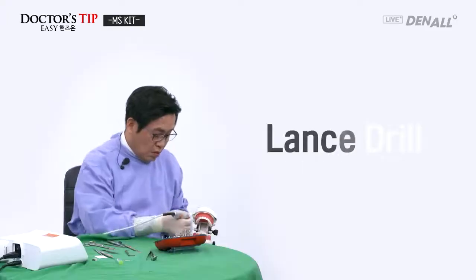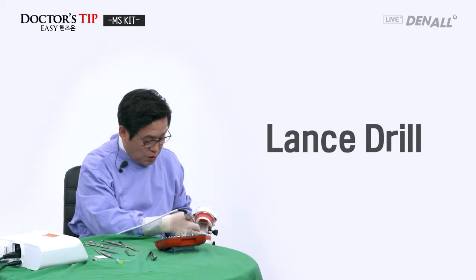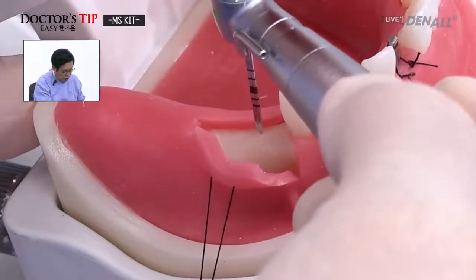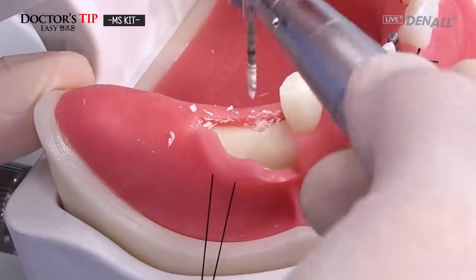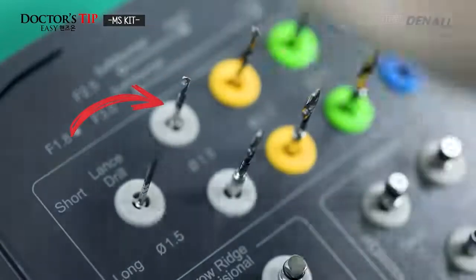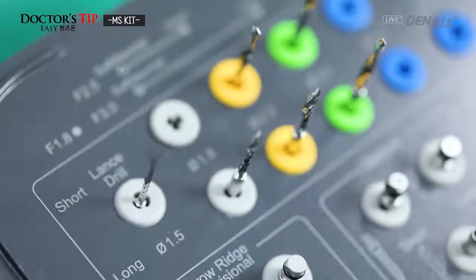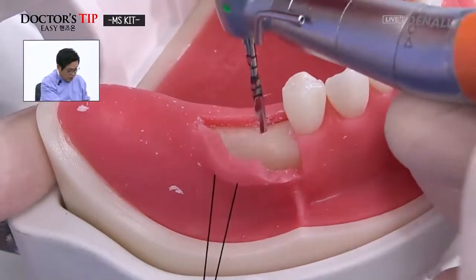Lance drill is used. After placing implants, I have to put in a provisional, a temporary. I will show you how it's bent. A 1.8 diameter twist drill is used at RPM 1200, like this.